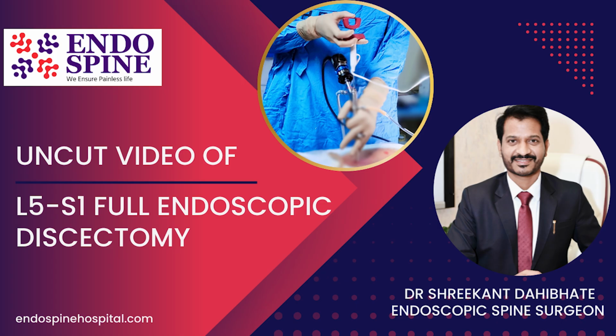This case is ideal because this is an L5S1 paracentral disc prolapse. At the same time, in this patient the interlaminar window is very wide, so this is actually an ideal case for the beginner to start with, because in such cases you do not have to do bony decompression, so you can just do the flavotomy and you can complete your entire surgery within just a small flavotomy incision. So let's begin with the MRI.